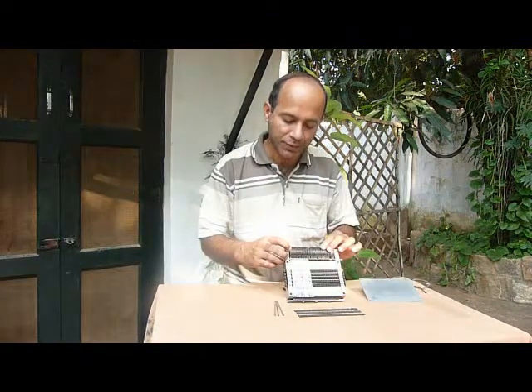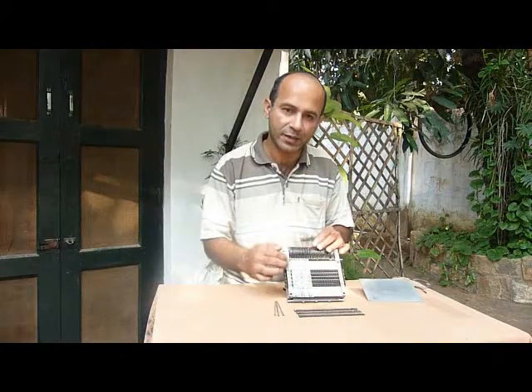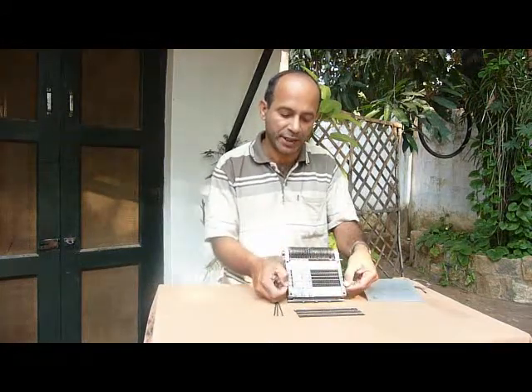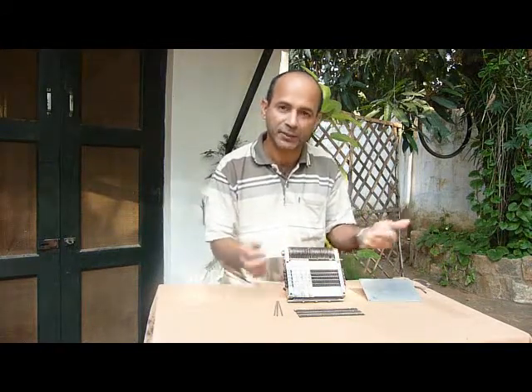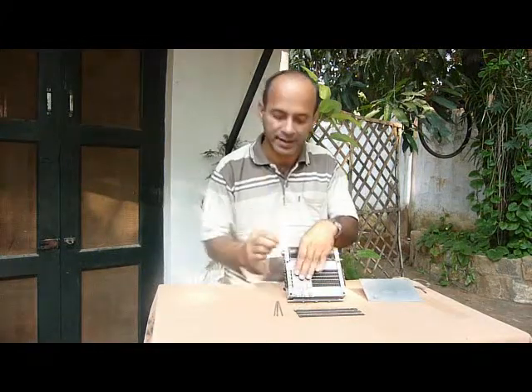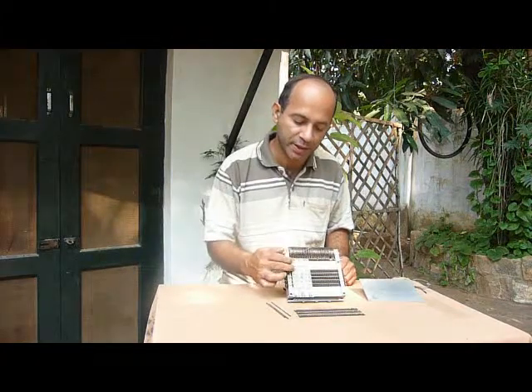Then the cam keeps rotating, it moves to the next position. The next column slide opens, data is set and reset again, and that sequence follows all the way from left to right on this display. Rows and columns are basically what we are dealing with over here. The columns are the opening and closing of the column slides. The rows are the actuating mechanism, slides with little miniature wedges. Now what happens is, only one column slide is open at any given moment while the other slides are closed. While refreshing, the slides open sequentially from left to right.